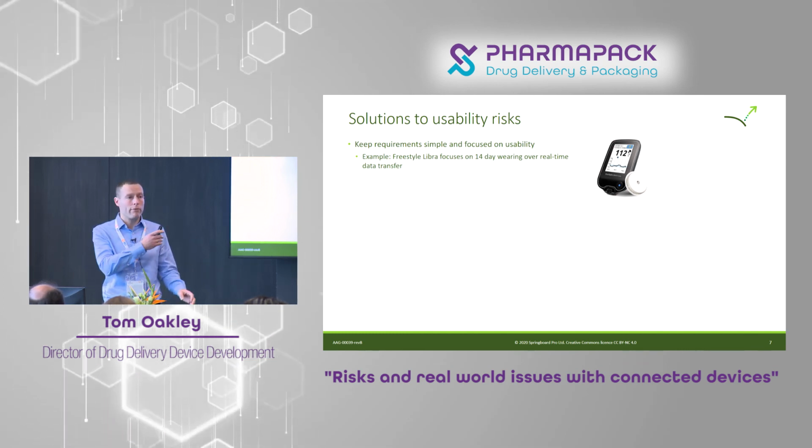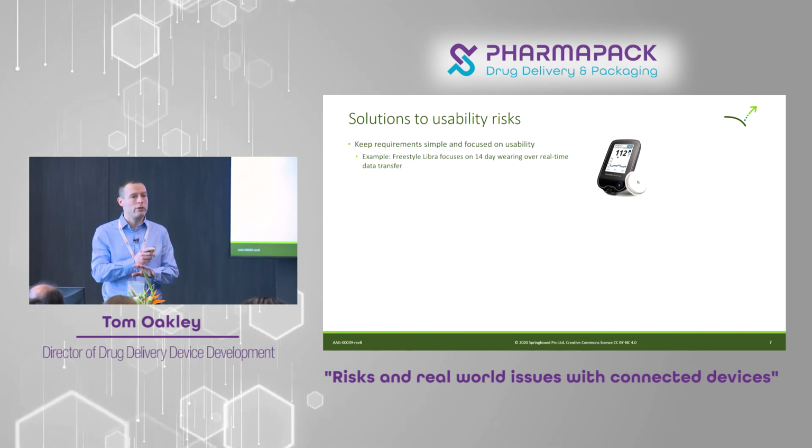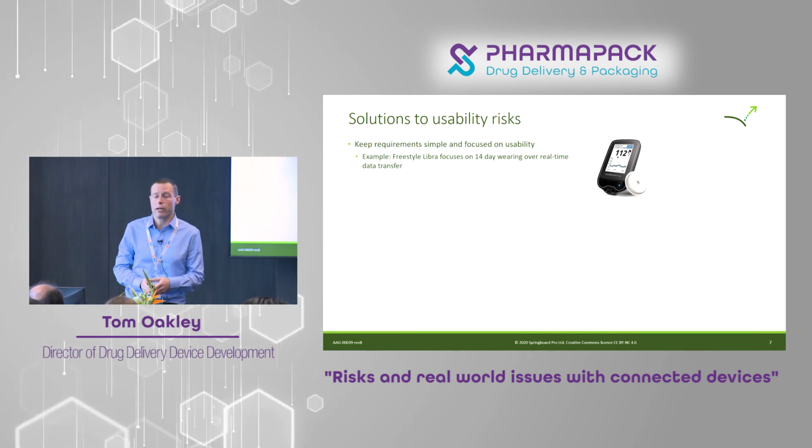So it's something that you have a small bit of interaction with, but it massively simplifies the device, and you cut out all of this real-time reporting overhead. So it's a very simple way of doing something. It's been very successful on the market.